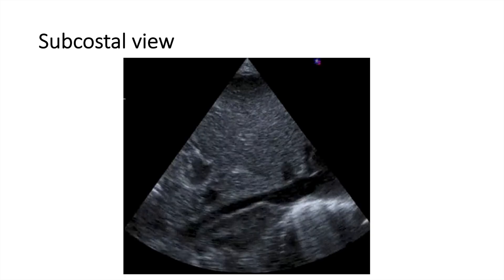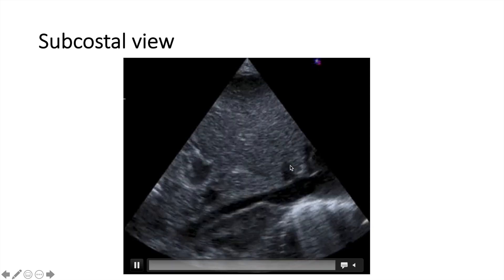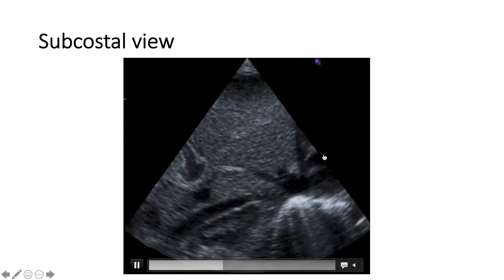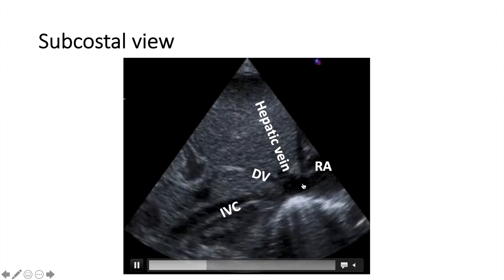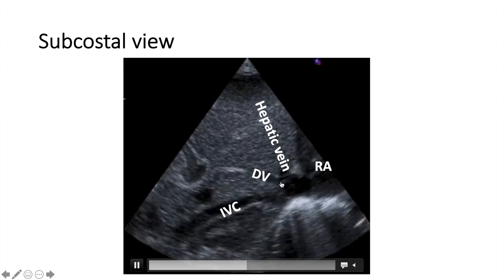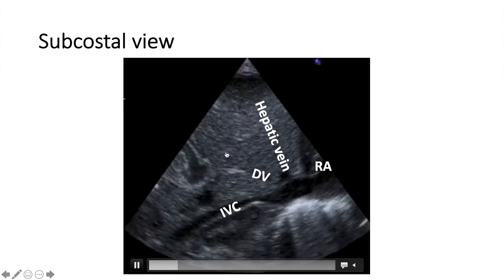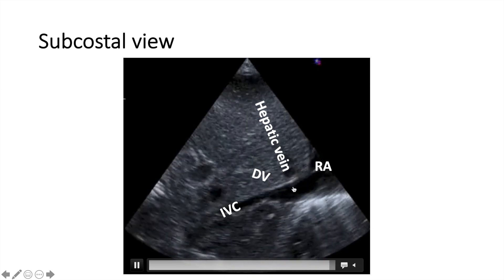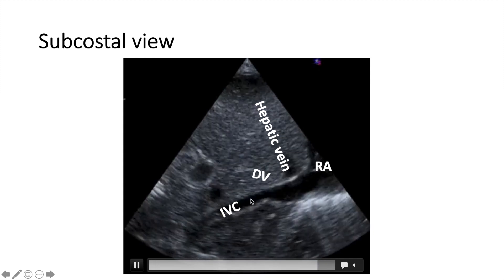From the subcostal view, we can also get some information. This is the subcostal view — you can see the liver here, and this is the IVC draining into the right atrium. This is the hepatic vein and the ductus venosus. Sometimes you can see the UVC coming from the ductus venosus towards the right atrium, and sometimes you can even see a PICC line if there is one in the IVC.